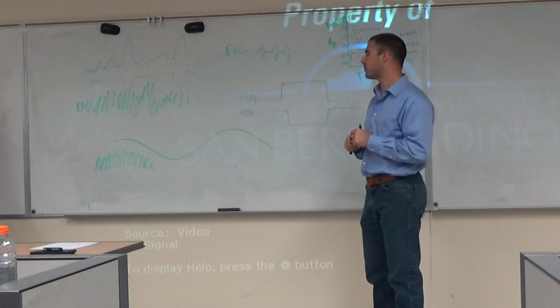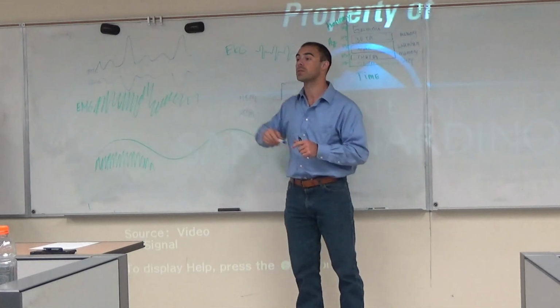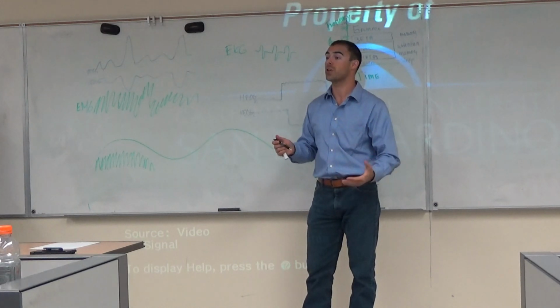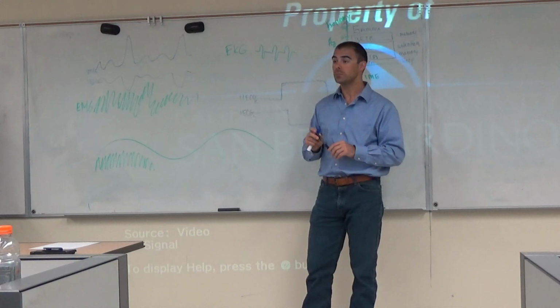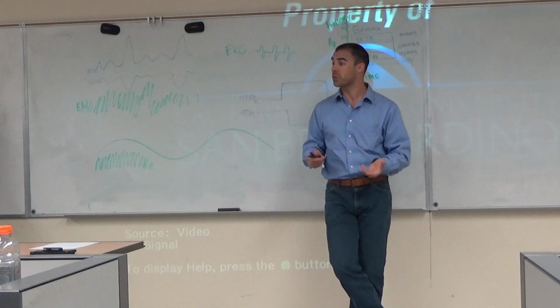Anybody have an idea for what you would do to deal with EMG? Yes, sir. Tell them to relax, yeah. You might instruct them, try not to clench your jaw. Try not to crunch your forehead. Like, don't react with facial lines. Yeah, this is why we do those practice sessions, right? Practice with them about it.